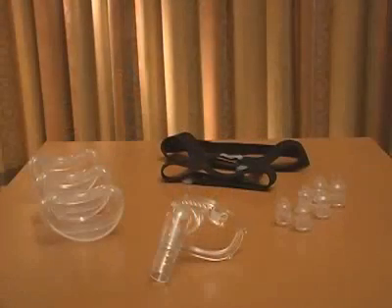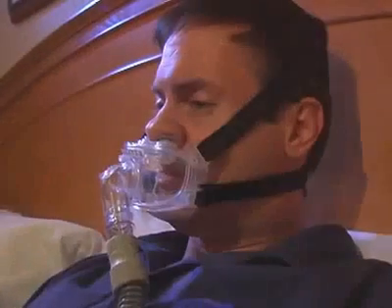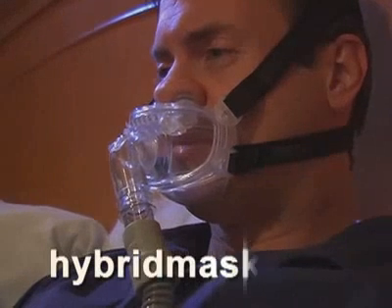If you are unable to resolve leaks, you may need to try one of the alternative nasal pillow or oral cushion sizes included in your hybrid interface package. For more detailed fitting instructions, please reference the hybrid fitting tips video located on this CD and on our website.